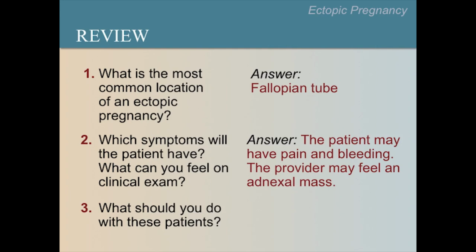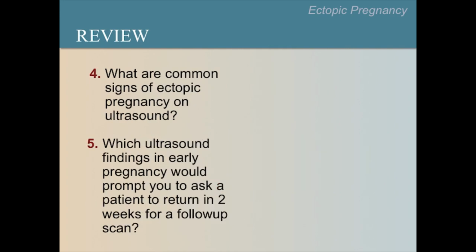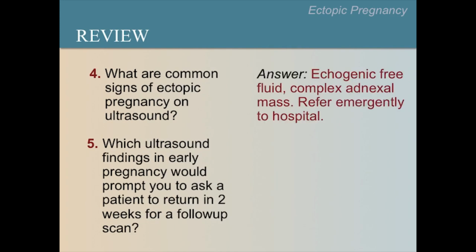What should you do with these patients? The answer is an ultrasound. If the ultrasound suggests an ectopic pregnancy, send her to the referral hospital immediately. What are common signs of ectopic pregnancy on ultrasound? Common signs include echogenic free fluid and a complex adnexal mass.